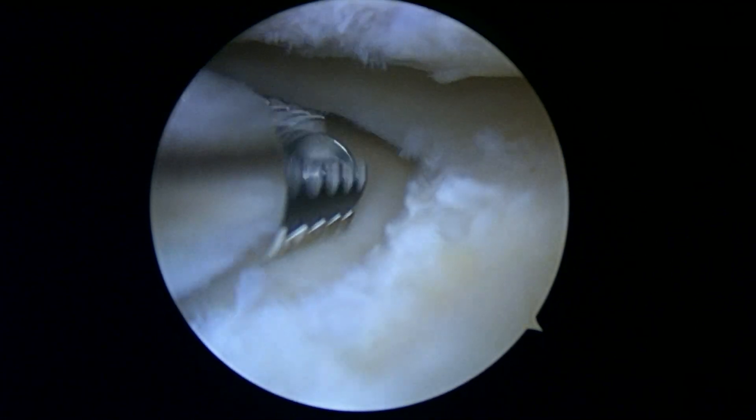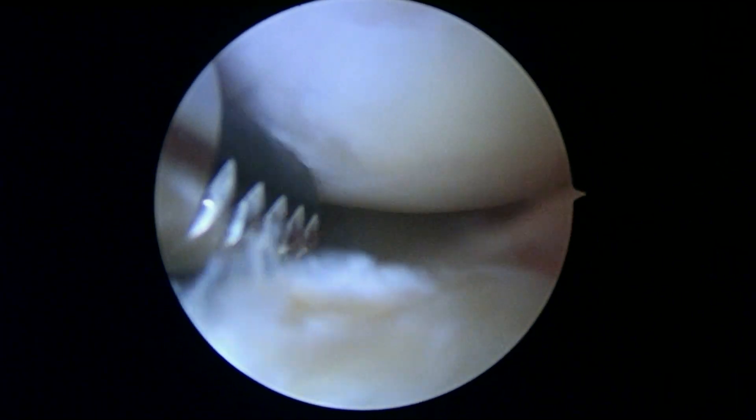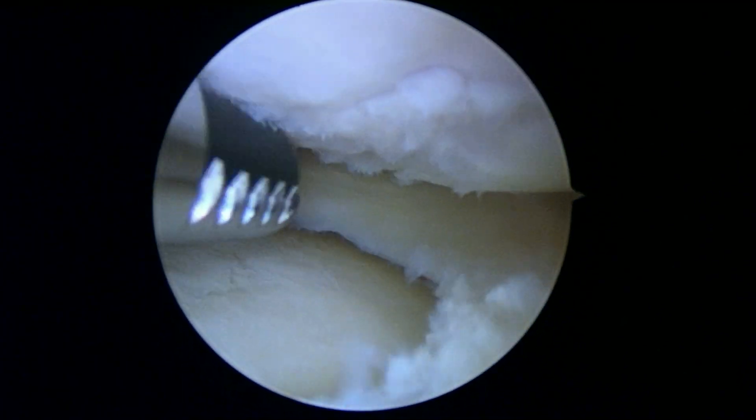We're done working on this lateral meniscus. It's interesting to note you've got some arthritic changes here. You can see the femoral condyle up above is not quite as smooth as it used to be, and some of these little areas are a little bit unstable, so we're just trying to do what's called a chondroplasty here to make sure that nothing's really loose.